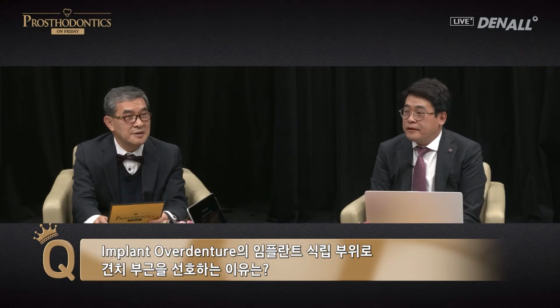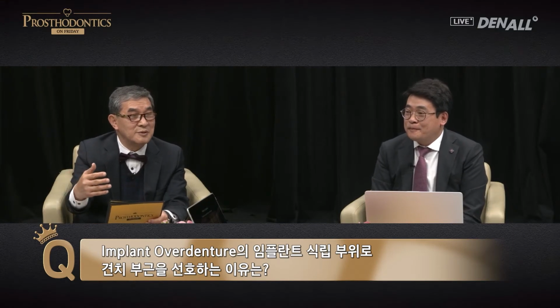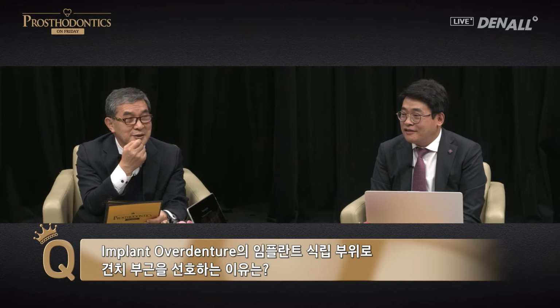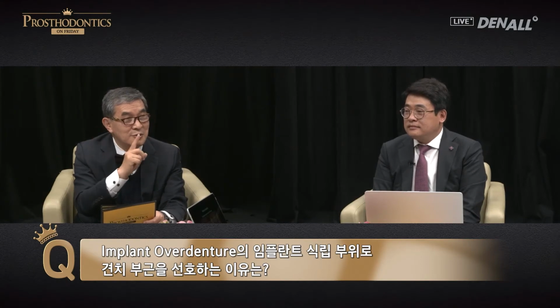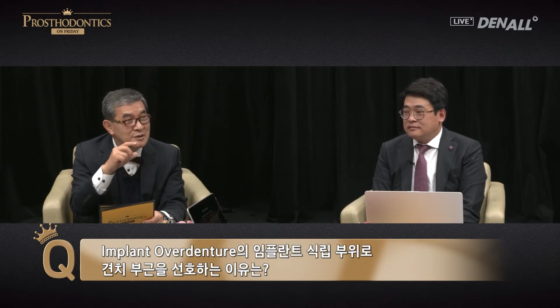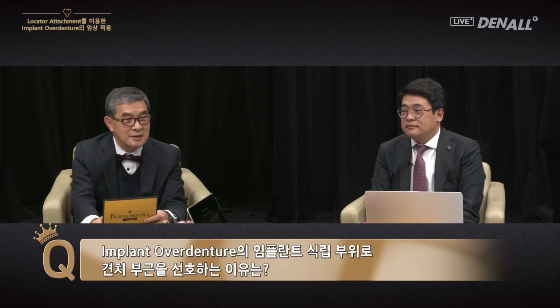When I taught in college, I brought in students in their third year in dental school and did perio tests from tooth number 1 to 7, both in the upper and lower, and the result was that the periotest value was the best in canine. When we just think about it, canine is a single root tooth. On the other hand, number 4 and number 6 have 3 roots. How come canine has better results?